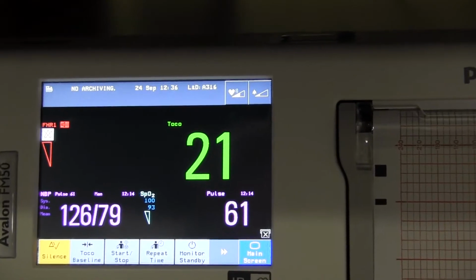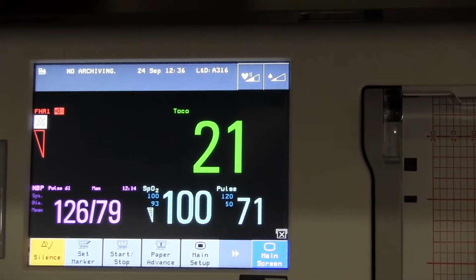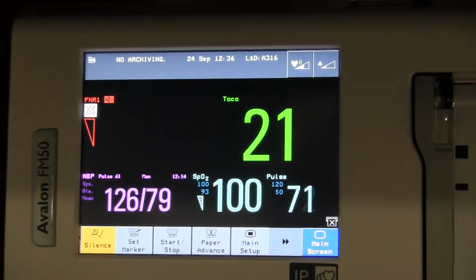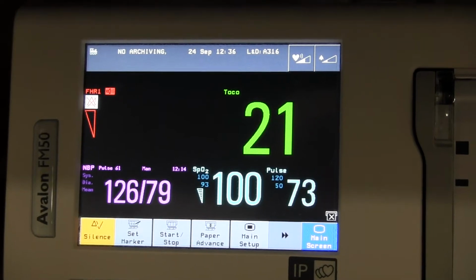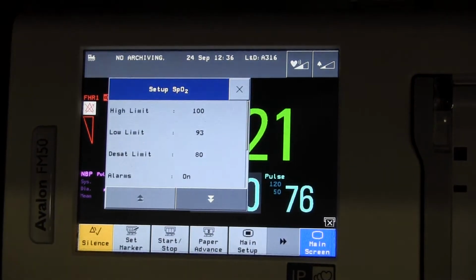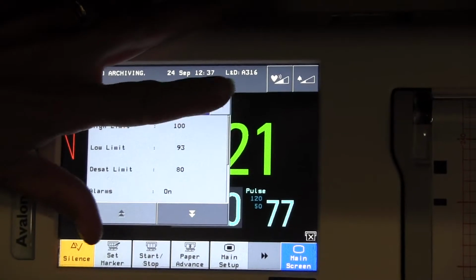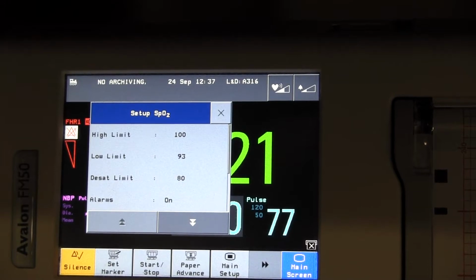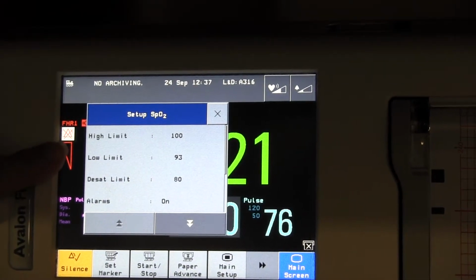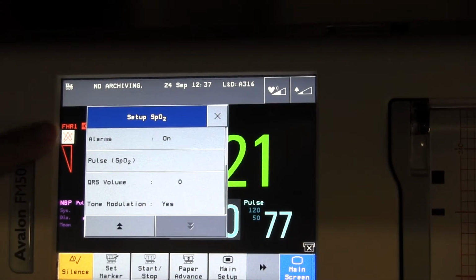The monitor has a touch screen. Everything you need to operate the monitor, other than to turn it on or off, is located on its screen. For example, when you touch a number, the setup menu for that measurement opens. Most screen elements are interactive. By touching the number on the screen, you can change the high and the low limits, turn alarms on and off, and change volumes up, down, or off.